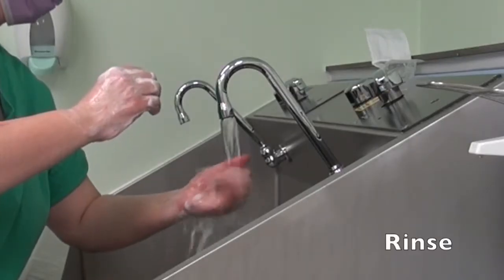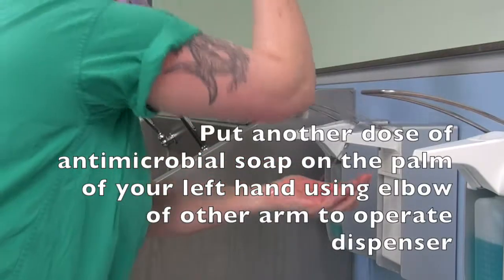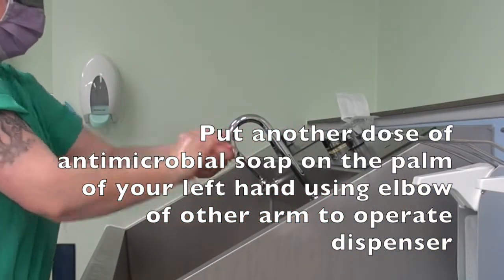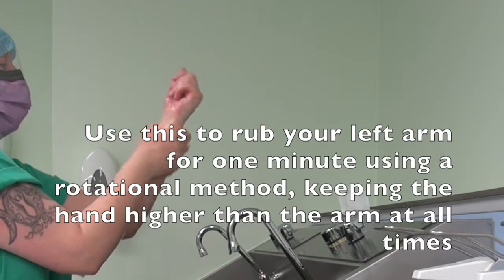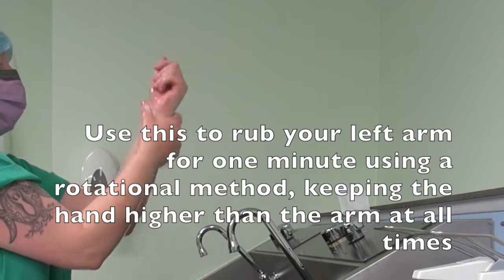Rinse. Put another dose of antimicrobial soap on the palm of your left hand, using the elbow of the other arm to operate the dispenser. Use this to rub your left arm for one minute using a rotational method, keeping the hand higher than the arm at all times.